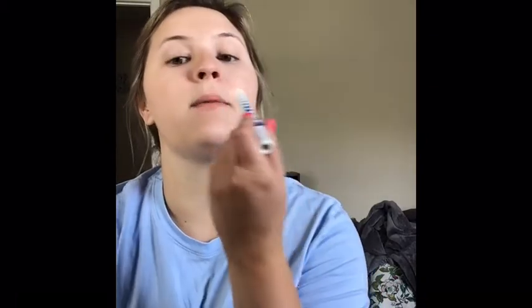So after I get my tape ready, then if I didn't already have gloves on, I put on clean gloves, do my hand hygiene, all that good stuff. I want to assess their nasal passage with my pen light. So I'm just going to take my pen light and look up at their nose here. I want to look for any obstruction, any polyps, any irritation, and any septal deviation.